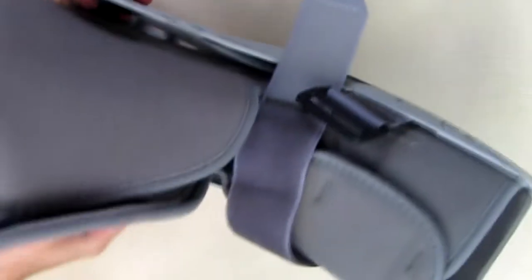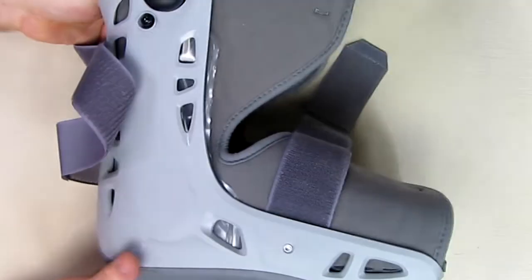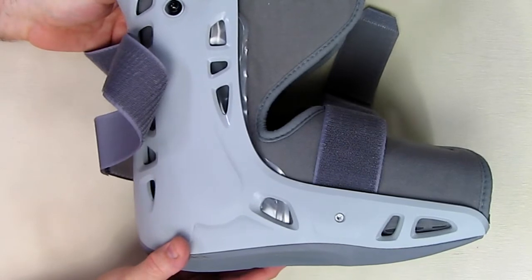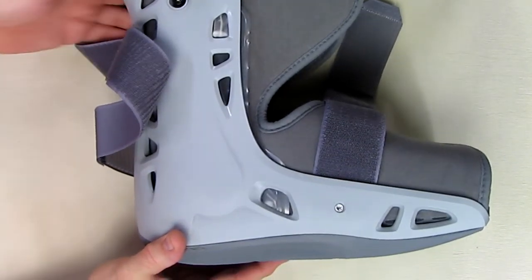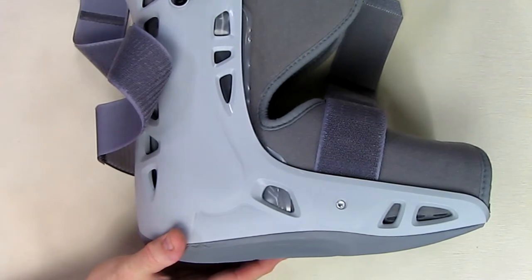I'm going to show the video from the manufacturer of how you actually put this shoe on. This is also a universal design and it's lightweight — even though it looks big, it's actually lightweight. This is the large size.